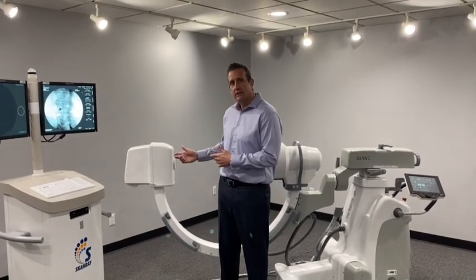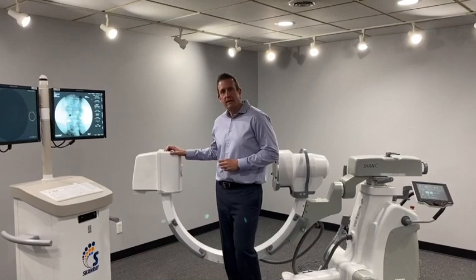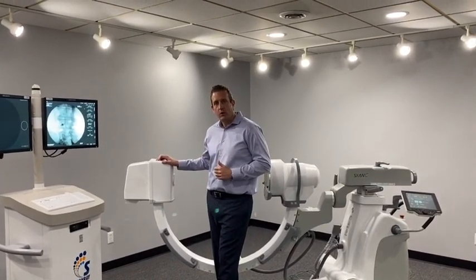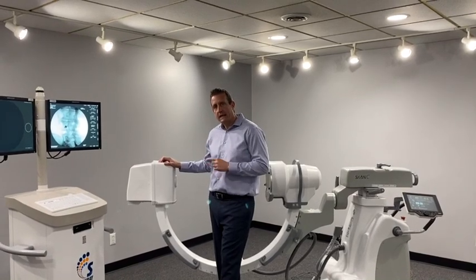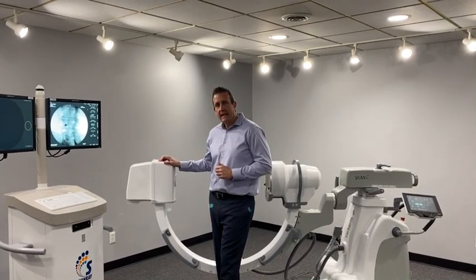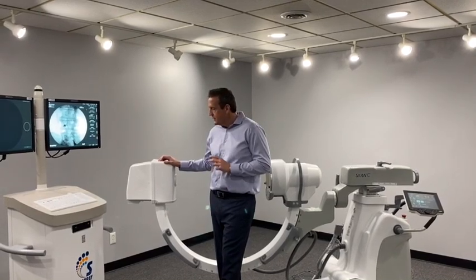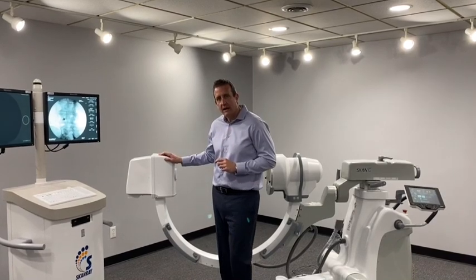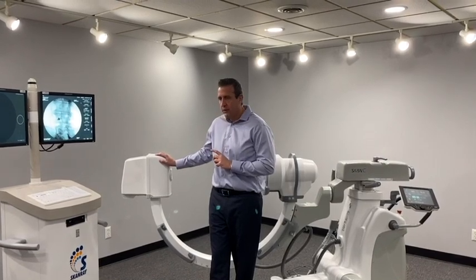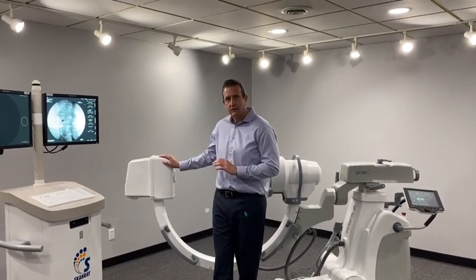I want to start off by talking about the X-ray source, which is one of the most important components of the system. The name of the company is CEI. The company's been in business for 65 years. They're the third largest tube manufacturer in the world, located in Bologna, Italy. I actually had a chance to visit the plant a couple months back — it's a very impressive facility. It's actually owned by ScanRay, so they keep all the quality control in-house. They believe in quality of product versus quantity.